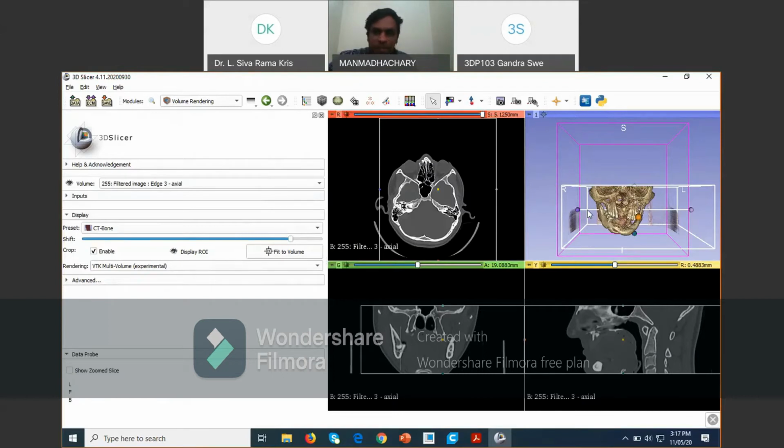Will you be explaining again step by step, or do they have to follow your lecture now? Already step by step is there, sir. When we are doing the processing, I will explain once again. Some participants are telling they are unable to get the skull image. So many problems are coming up online, so once again we have to go one by one.